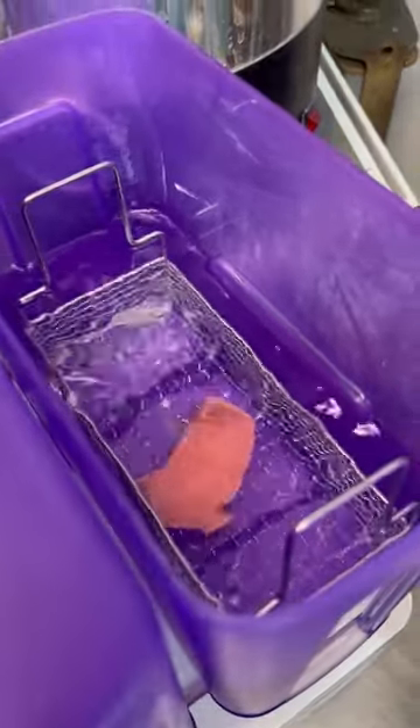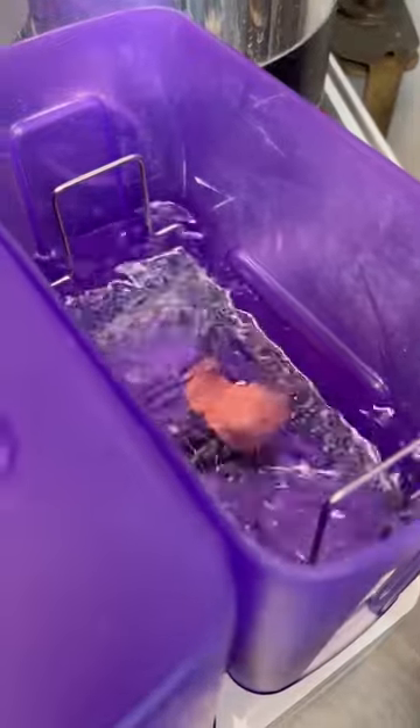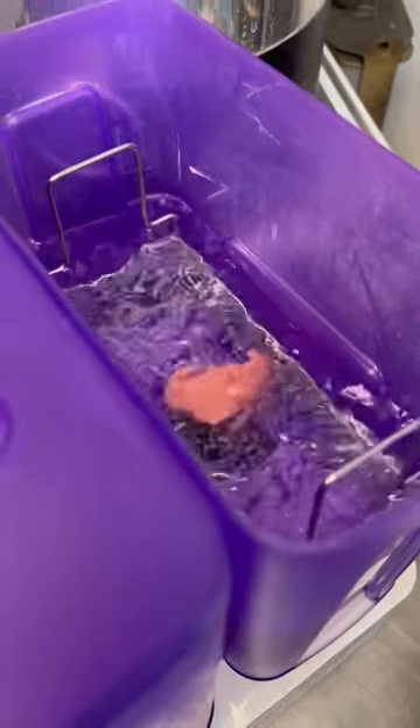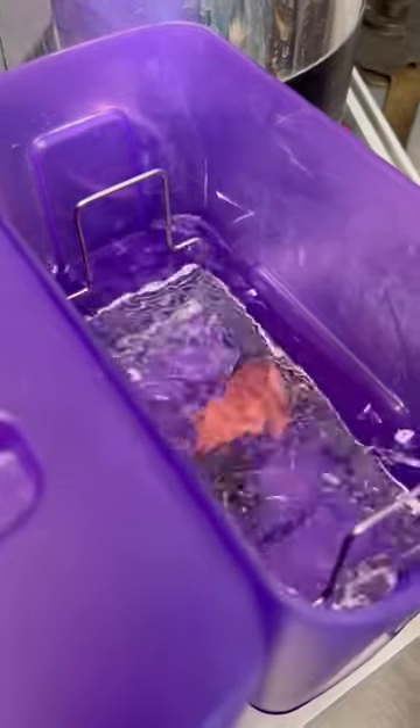After that, I'm just going to lightly sandblast that area. So when I put the teeth in place, they will hold so tight that it's going to be almost impossible to take them off. So when I actually remove the matrix, some of the glue and the putty stays in there, and then I'll use a little bit of glass beads to clean that all up.